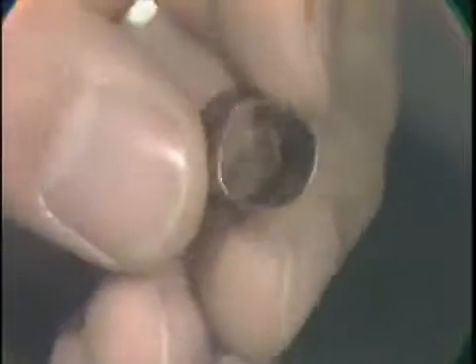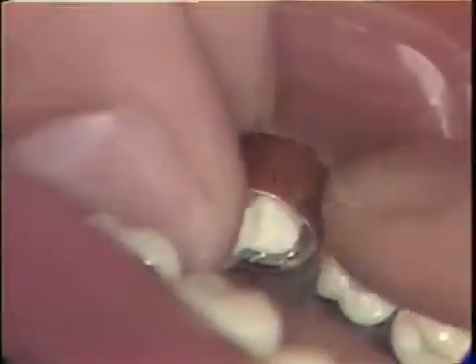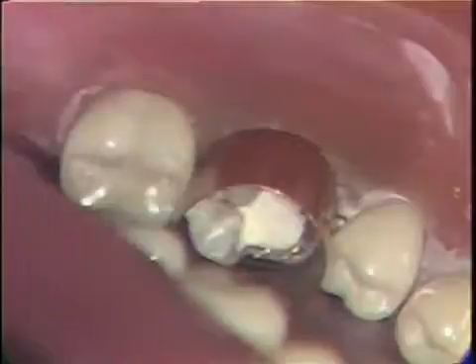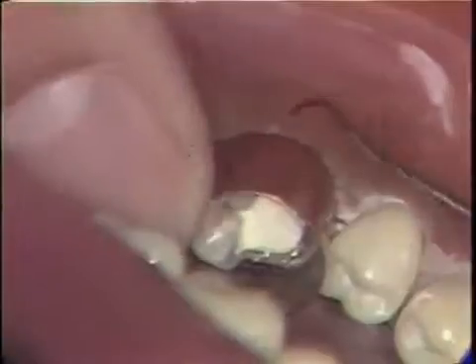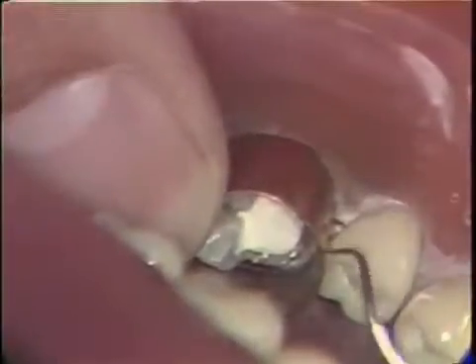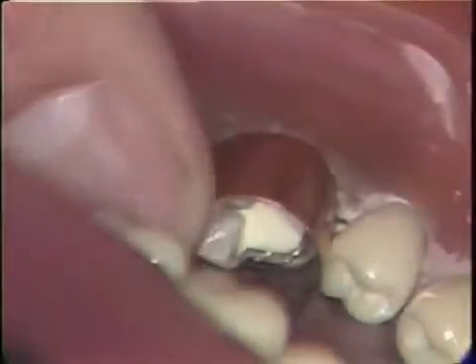A copper band is selected for the tooth. It is important to select a band which just tightly fits around the cervical area of the tooth — it must not be loose and sloppy at the cervical so that amalgam will extrude out around the band. It is also important that the band not be pushed too far cervically so as to lacerate the gingival tissue. The cervical area of the band is marked with an explorer to follow the free gingival margin, and the mesial and distal marginal ridge heights are marked for trimming.